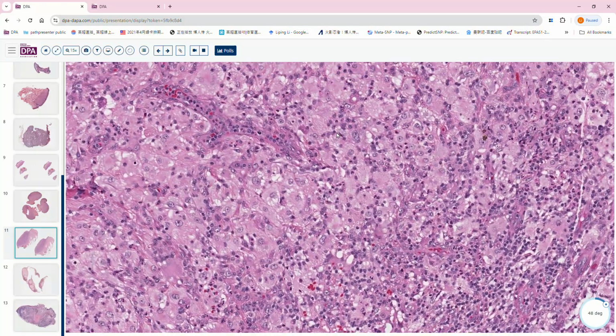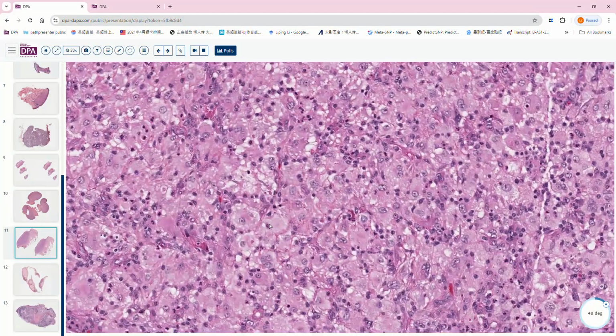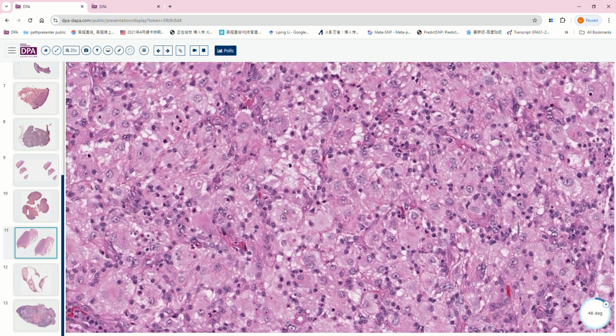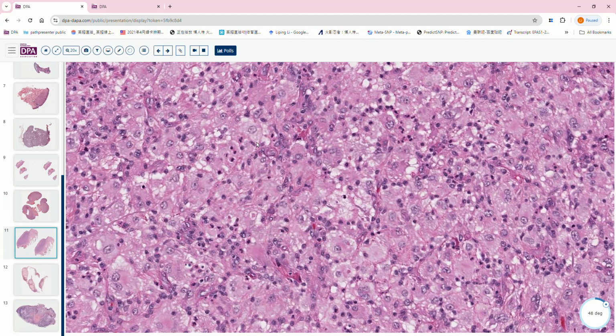And for this one, we have really characteristic cells like this histiocyte. They just engulf some maybe red blood cell and other inflammatory cell. So if you think about this diagnosis, you will always pay attention to this. This phenomenon is emperipolesis, not specific for Rosai-Dorfman, but if you think of Rosai-Dorfman, you will try really hard to convince yourself that it's emperipolesis.